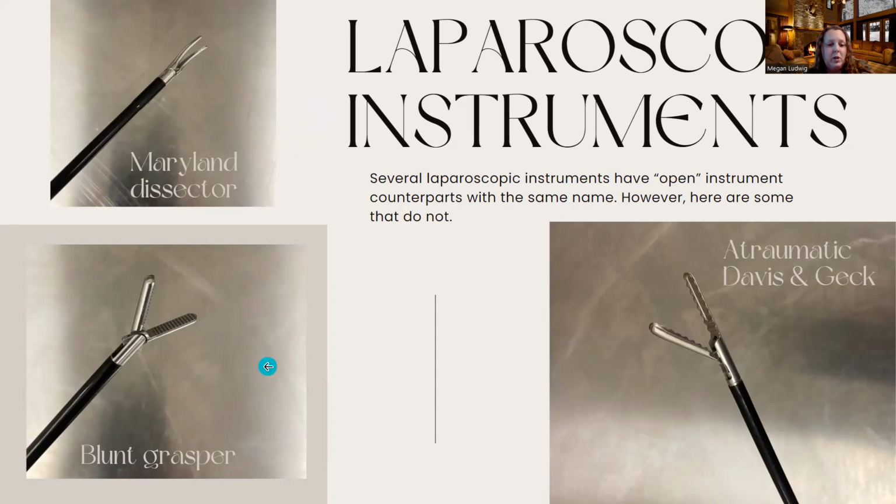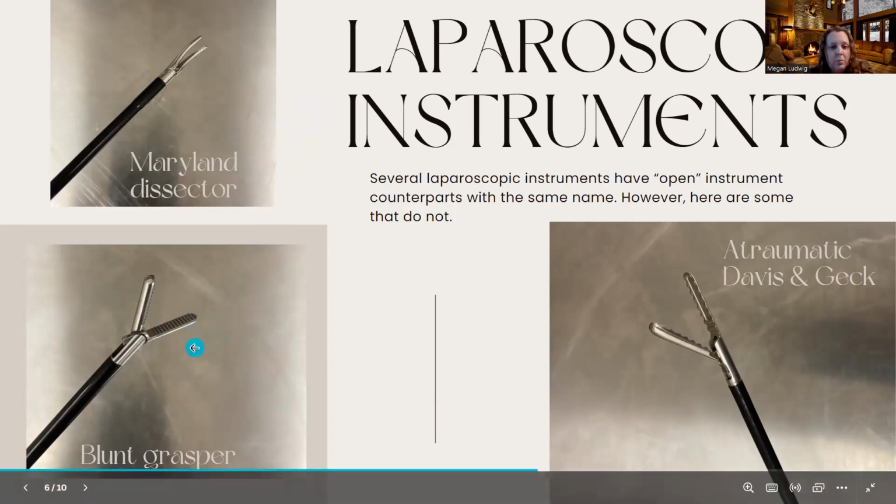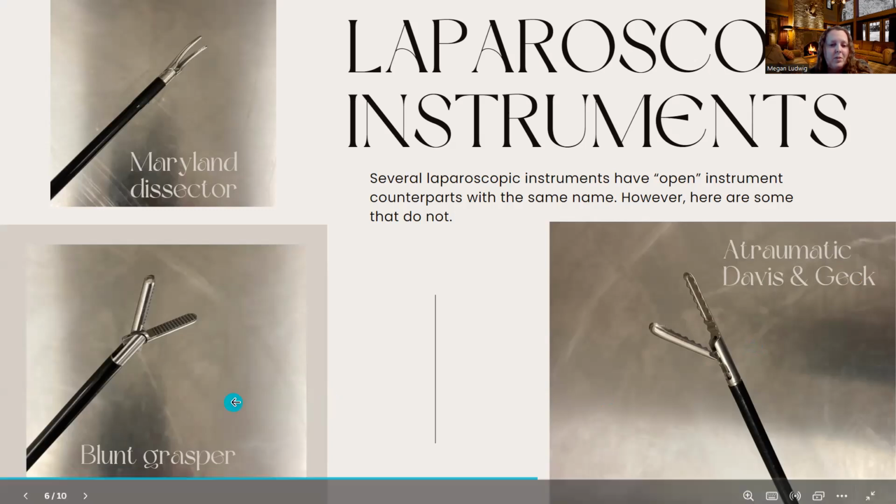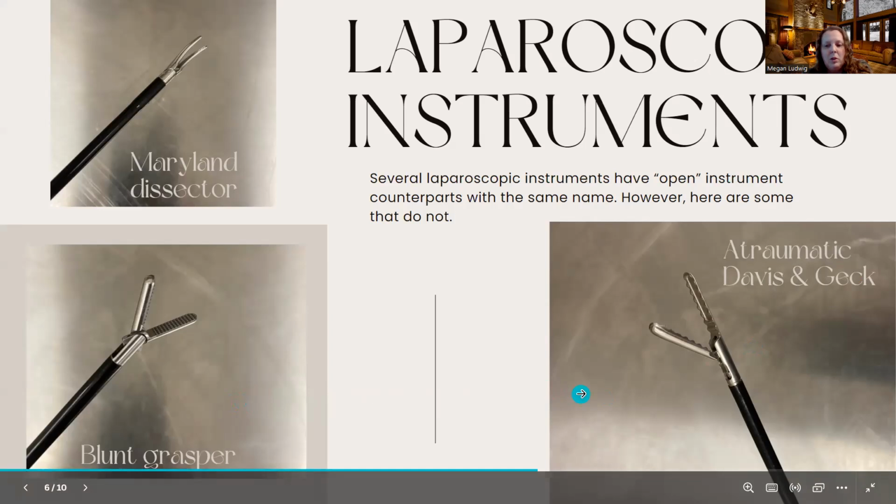Now this is a blunt grasper. This is kind of a generic name. I think there might be other names for this in other parts of the country. We just call it a blunt grasper. So it has no teeth, but it's just used for general grasping inside the abdomen. And then this over here, it is similar and could really be used in similar fashions, is the atraumatic Davis and Geck. So these are not teeth. If you look closely, they're just kind of serrations, maybe a little more grabby than this blunt grasper, depending on what you're trying to do.